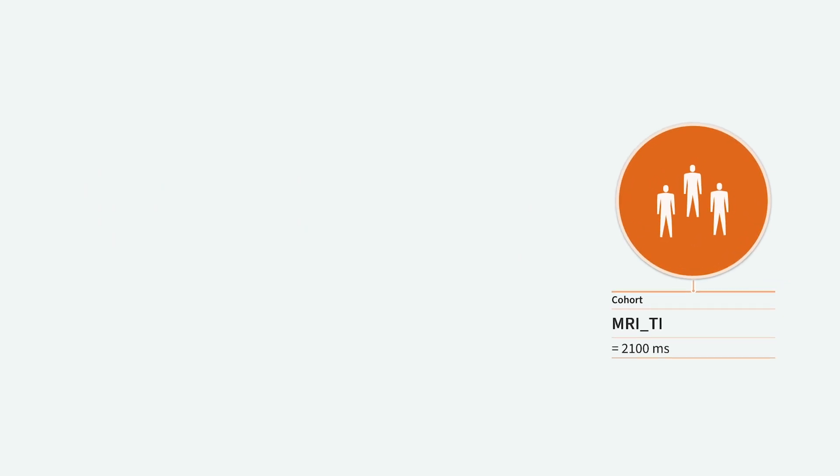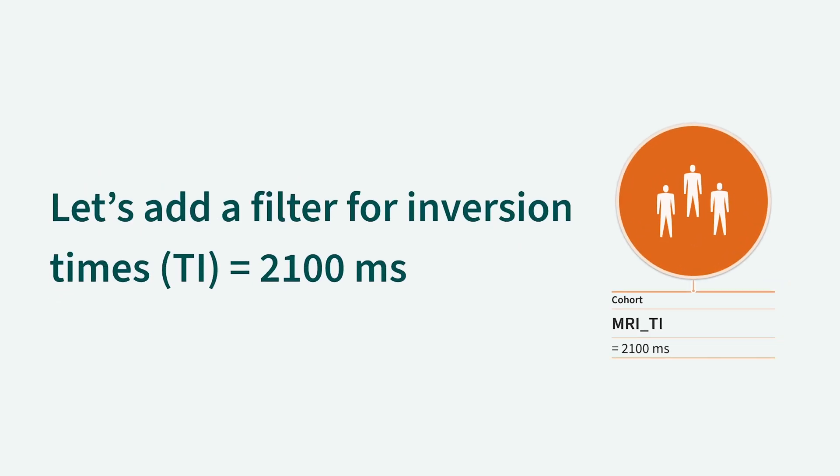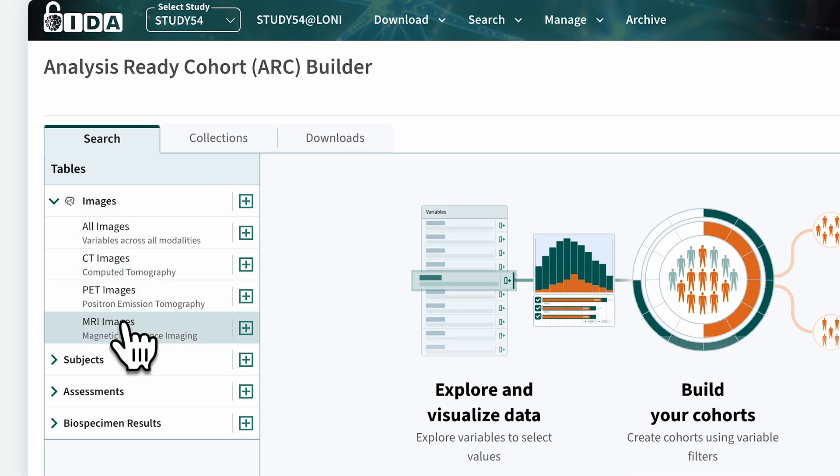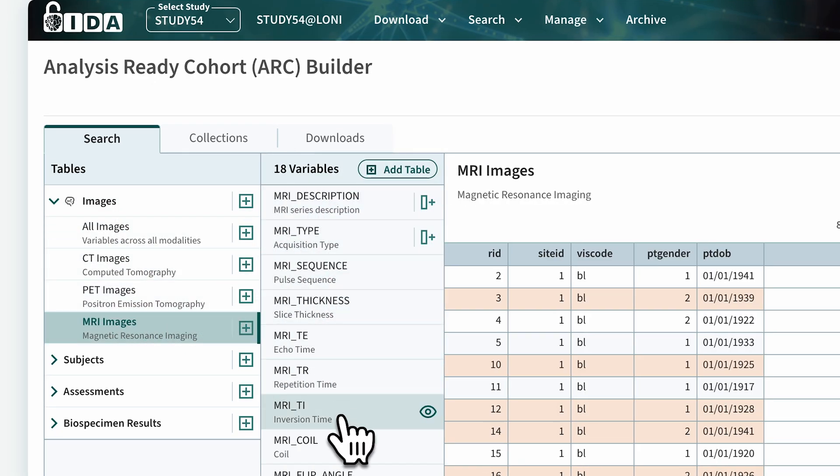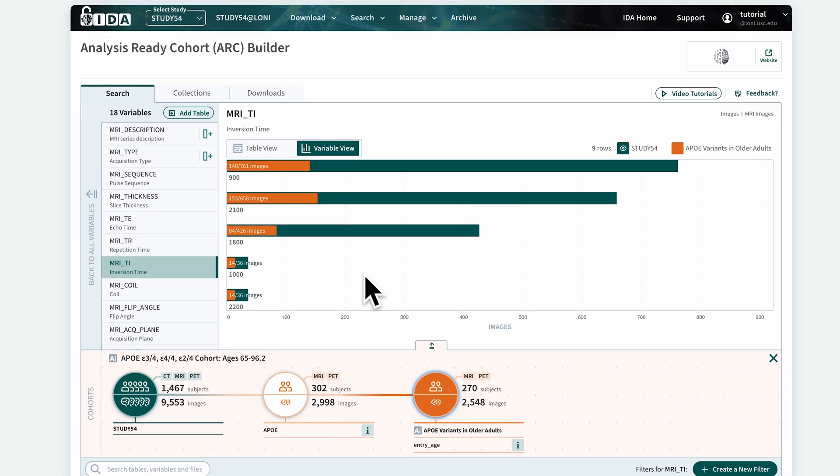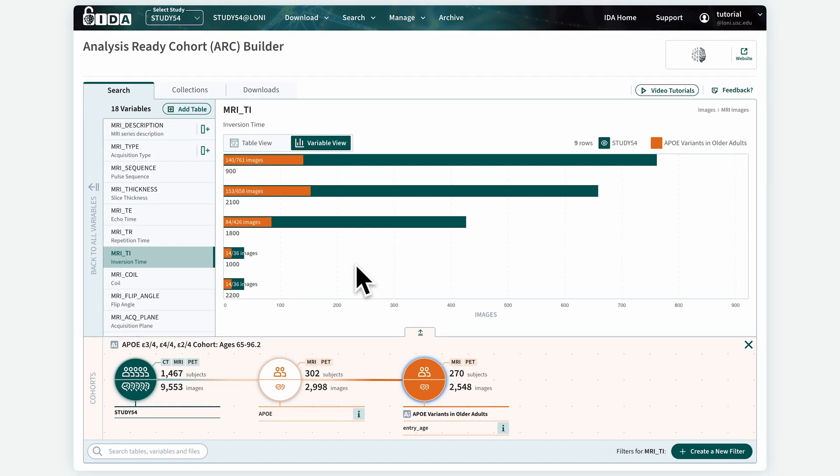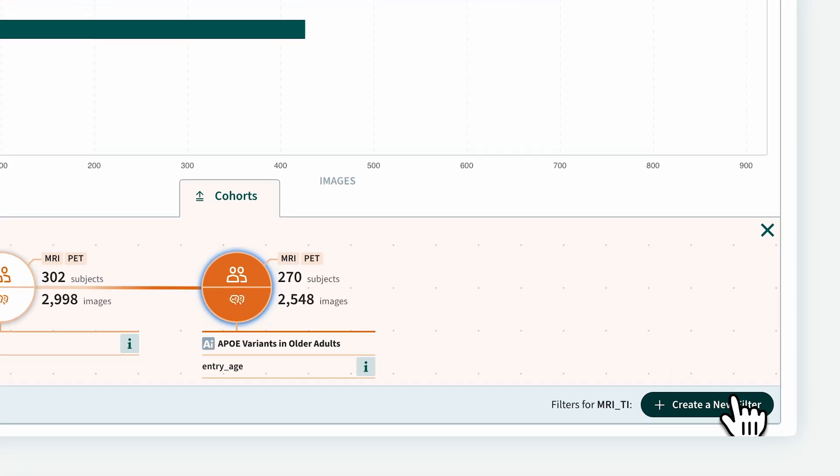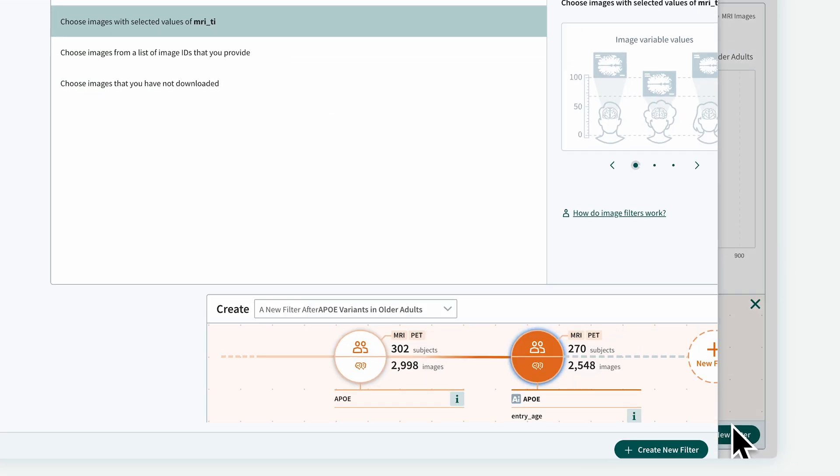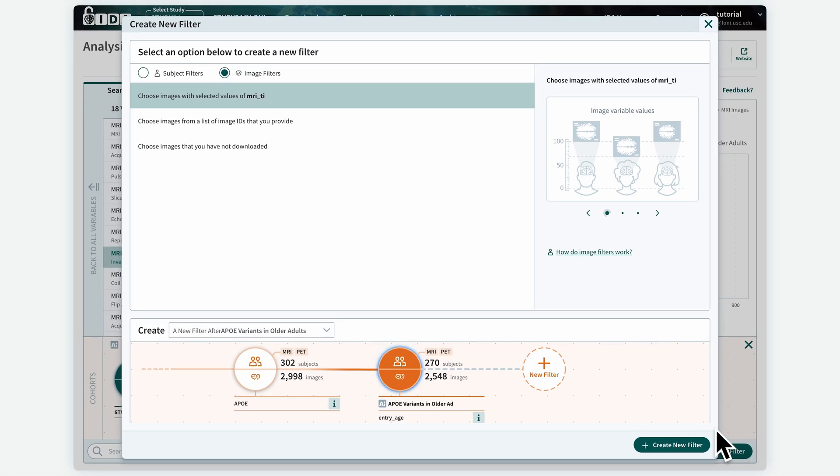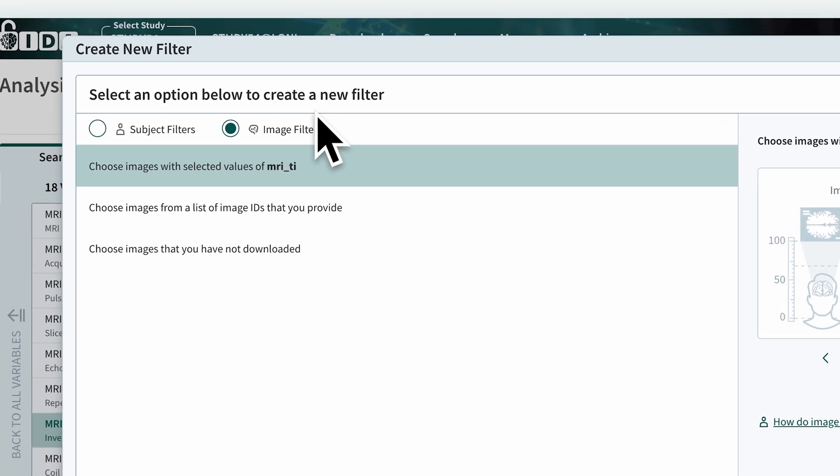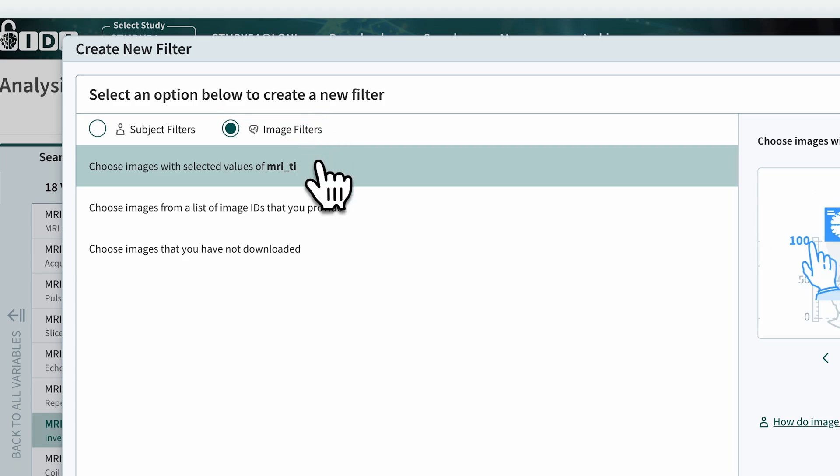First, we will add a filter for inversion times equal to 2100 milliseconds. Choose the MRITI variable in the MRI Images table under the Images category. Click the Create a New Filter button to view filter options. Choose the Image Filter option. Choose Images with selected values of MRITI.